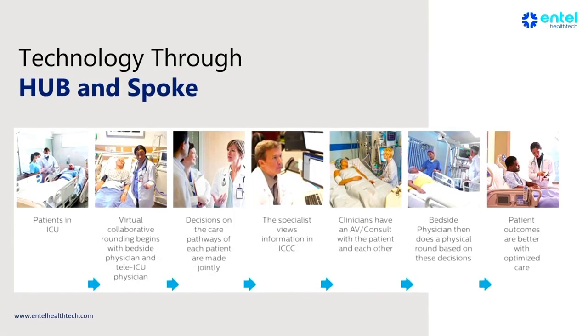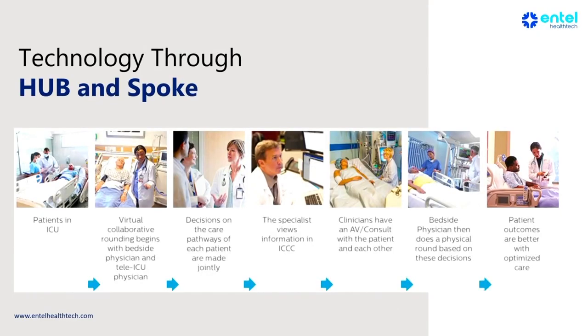The specialist is viewing all the information through the command center. The clinician sitting in the command center can talk with the patient. If the patient is awake, with the relatives, he can counsel, he can consult with the on-site consultants, and then the decision is taken on what to do. I think that will help to optimize the care. So this is a hub and spoke model.